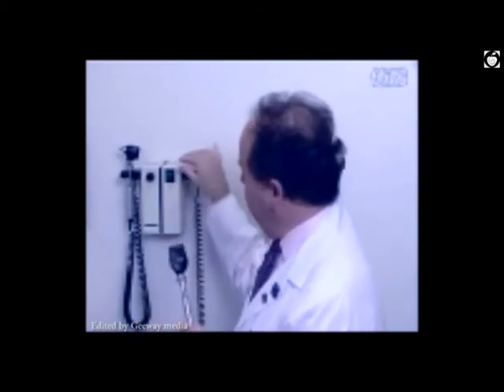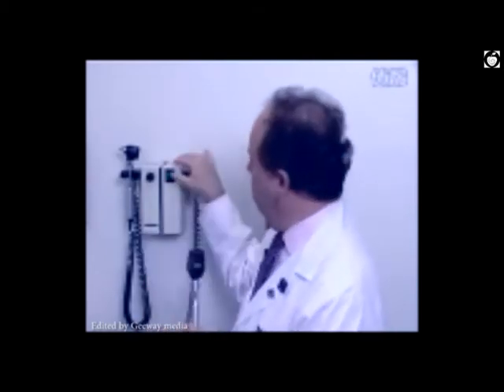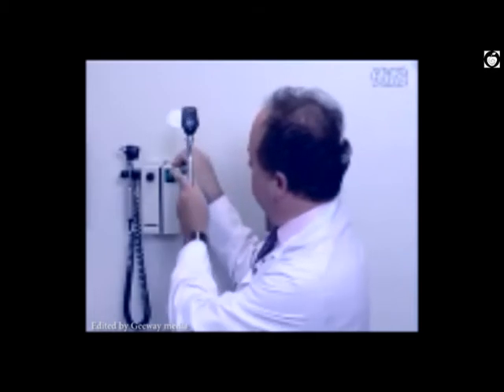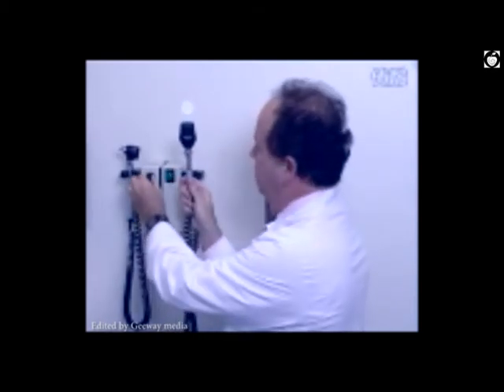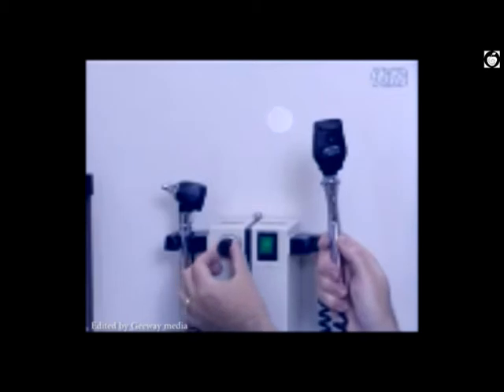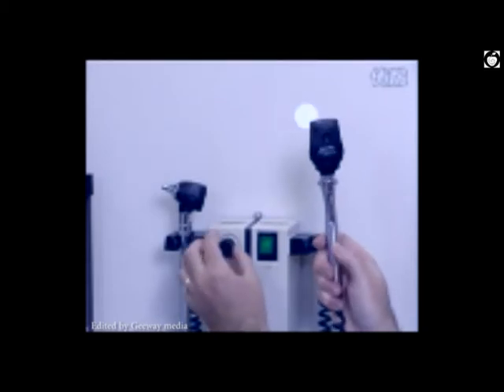The only difference is that instead of the control on the handheld unit here, one has the on switch here. And the control of the intensity of the light is by this knob right here. In the newer wall-mounted unit, the brightness control is in fact in the handle. When one places it back into the holder, the instrument is turned off.